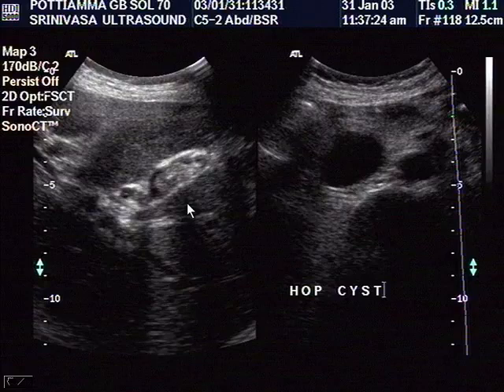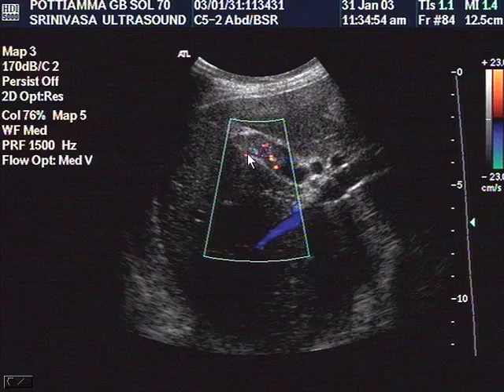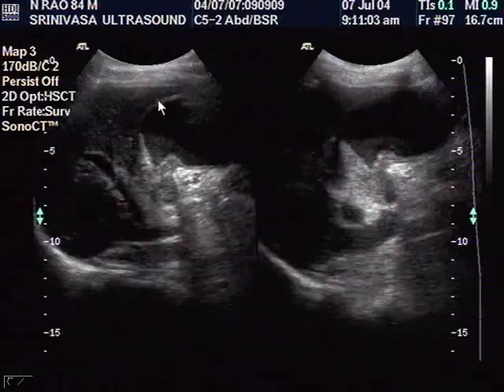Color Doppler helps us. You have tissue, or you have vascular signals over there. So I'm very, very worried about this particular one. It's a large polyp, and therefore I'm worried. Again, a gallbladder which is filled over here with a mass. I'm worried about this.